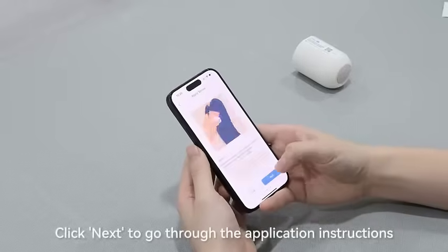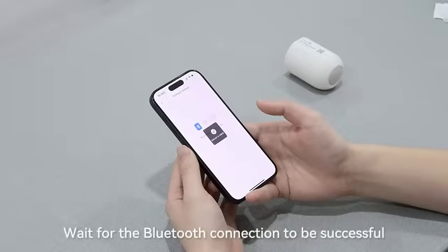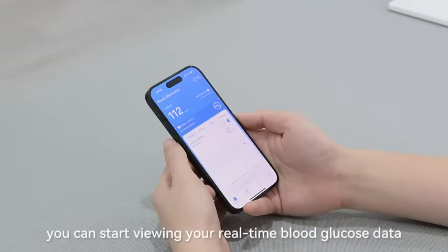Click next to go through the application instructions. Wait for the Bluetooth connection to be successful. Otai takes 30 minutes for the warm-up period. Once warm-up is finished, you can start viewing your real-time blood glucose data.